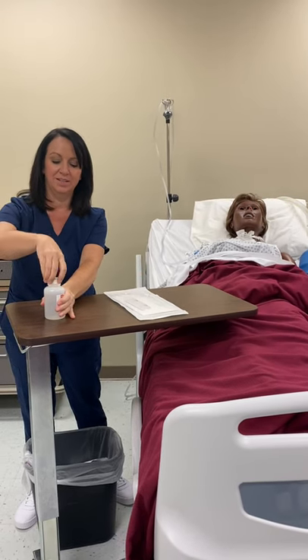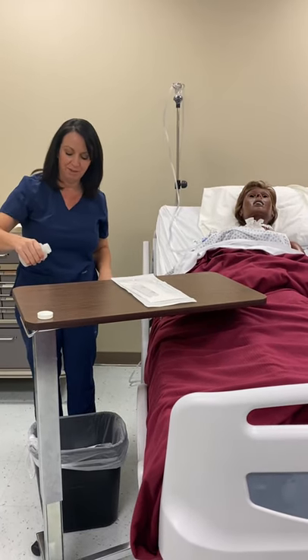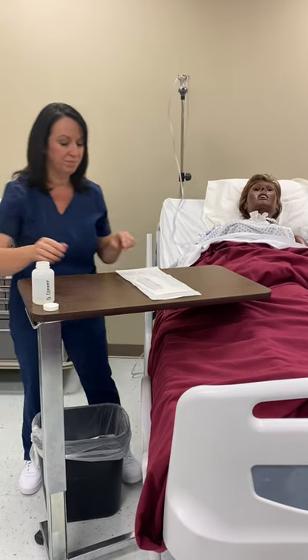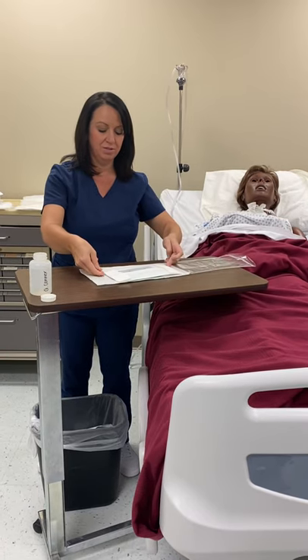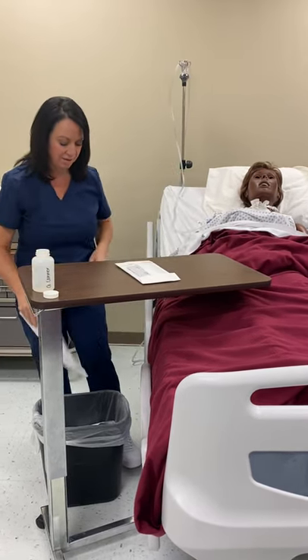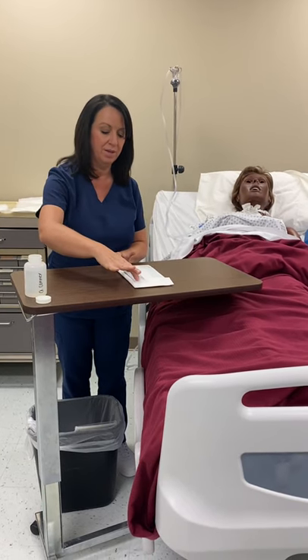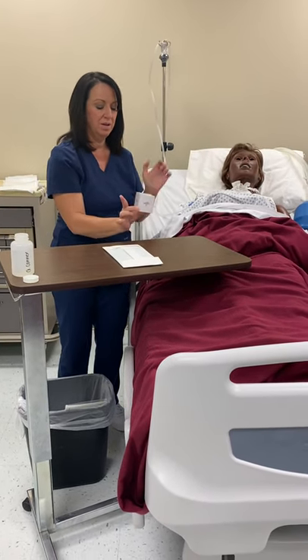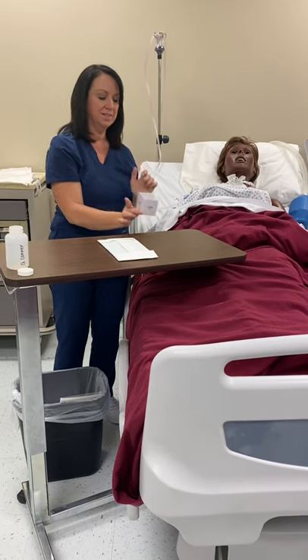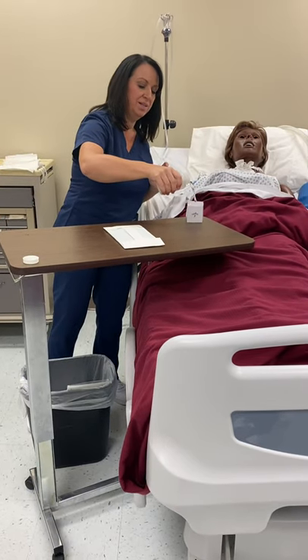I'm going to open my saline. That's a sterile field, so I'm going to put that out of my way. I'm going to palm the bottle and lift it to get it ready. As soon as I open this catheter, the first thing I have to deal with is getting this box for the saline. I can see my box — that's the bottom. I'm going to grab it, trying not to touch the top or the inside to keep it sterile. I'll put it out of my way and put some saline in there to get it ready.